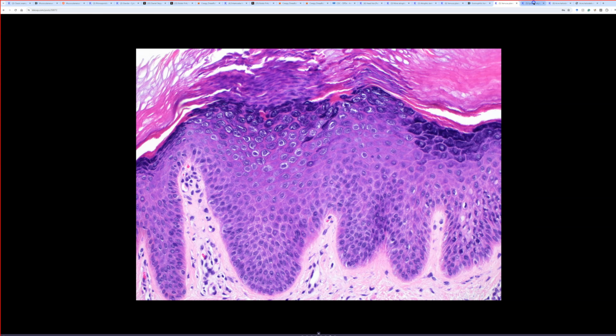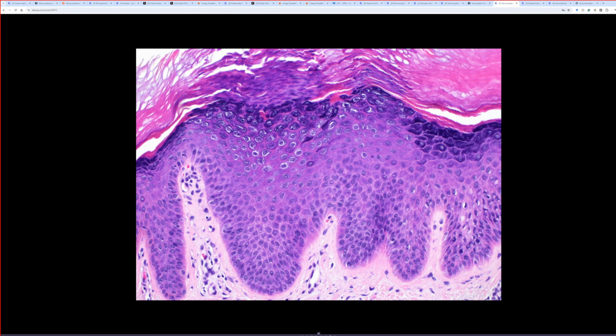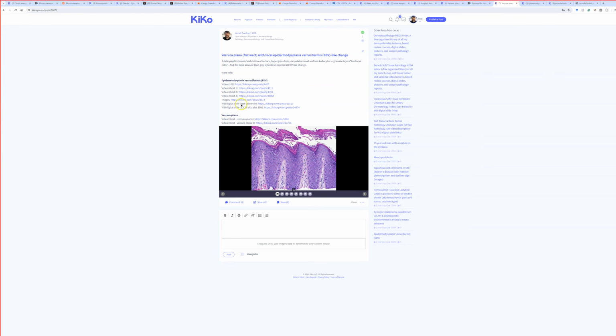All right. And we already did the EDV. So on these posts on Kiko, I've got more resources if you're curious about EDV and Verruca plana. You can go watch. I've got other videos and examples there.